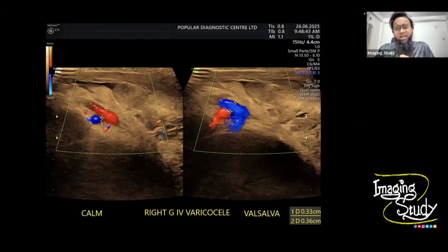Okay, so varicocele has 5 gradings in the Sarteschi classification, with a very easy technique. If you follow the technique and compare what urologists actually do in such cases, in grade 1 it is good to have a standing position to see the varicocele. It's easy to see the reflux, but we can also do it in the supine position. If we have confusion, we just turn the patient standing up.